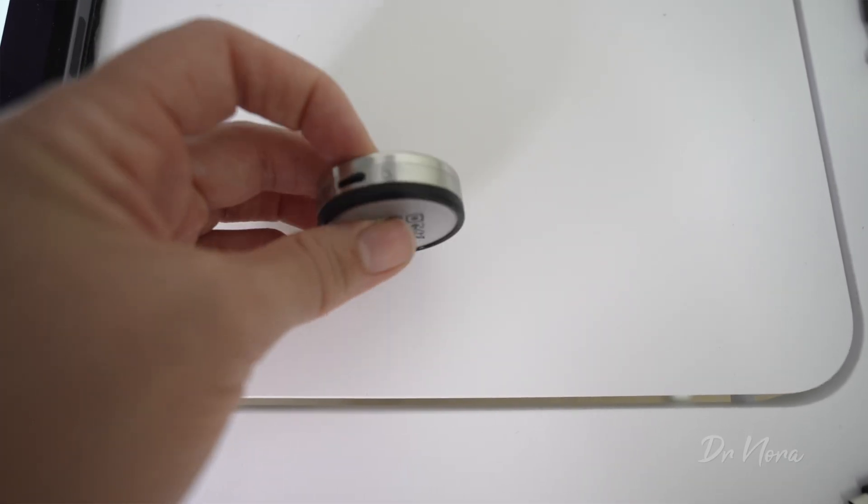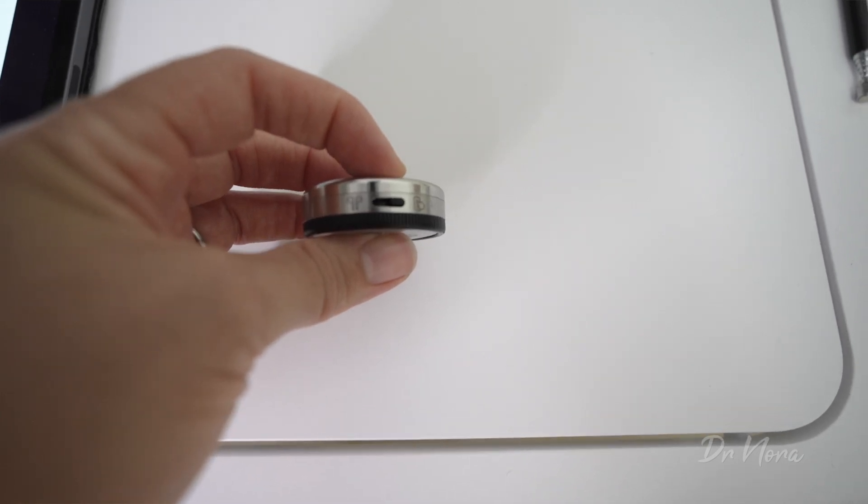On the side, it's got a charging portal and also has a little toggle on the end where you can change it for on, off, or even to listen through your headphones as well. When you receive the Stemscope, you should charge it up — it doesn't take too long. And if you are on the wards, you could just take it home, charge it up at night time, and then take it back with you to work.